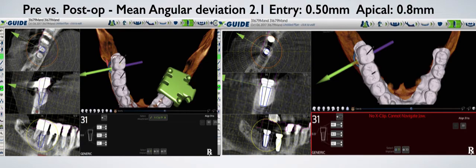How did we do? Our mean angular deviation was 2.1 degrees, our entry point 0.5mm, and our apical 0.8mm. Again, you can see the efficiency, the accuracy, and the precision of the X-Guide in everyday use.